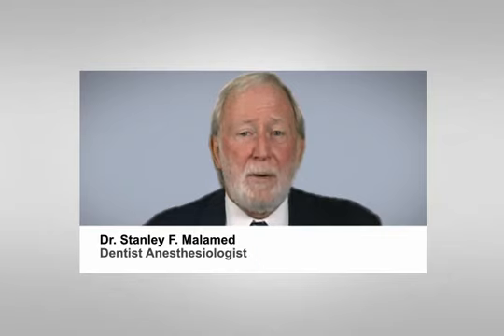The STA intraligamentary injection is virtually painless and is ideal for single-tooth anesthesia in either the maxillary or mandibular arch, providing profound anesthesia without collateral anesthesia to the face, lips, or tongue for procedures of less than 1 hour. It is important to realize that the STA intraligamentary PDL injection can now be used as your primary injection instead of the mandibular block injection when treating single teeth in the mandible. The PDL with the STA system is more predictable than performing the mandibular block injection.